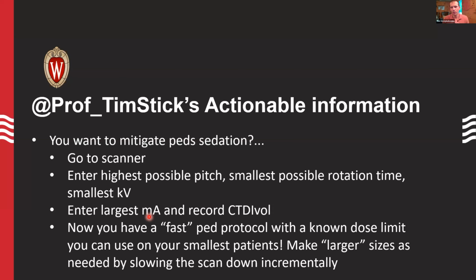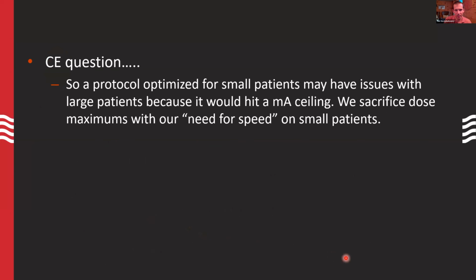You can save that protocol and call it PED newborn to, I don't know, 8 years old. And then you would know, okay, if I'm going to use it for my 9-year-old to 12-year-old, I'm going to take that protocol and slow it down a little bit. You could lower the pitch a little bit, or maybe increase the rotation time, either one of those, and you could use that protocol for a slightly bigger pediatric patient. So that's just some actionable advice to operationalize that.